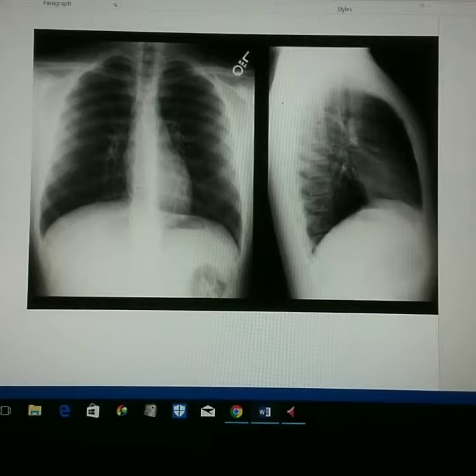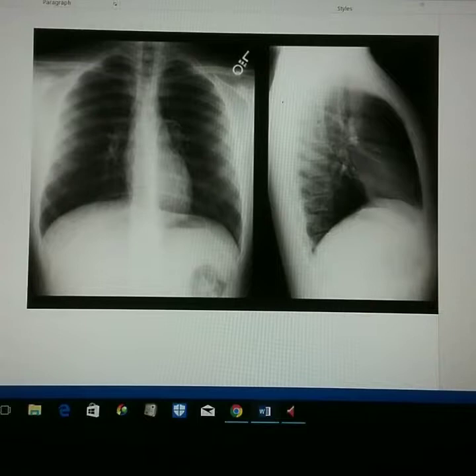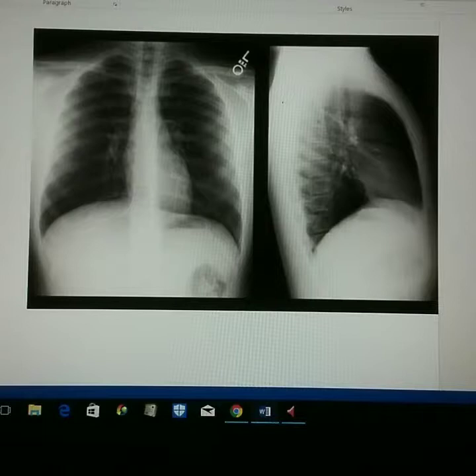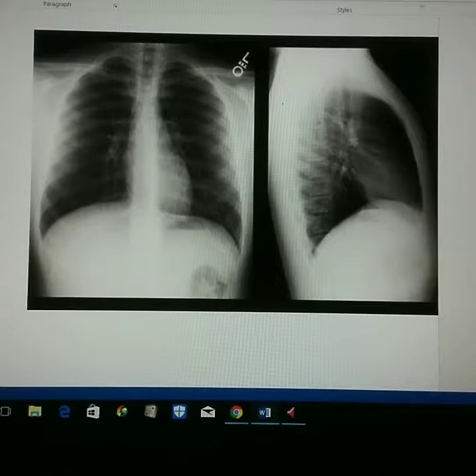We want to make sure that our patient was not rotated, evidenced by the sternal ends of the clavicles being equidistant from the vertebral column. We also want equal distance from the vertebral column to the lateral border of the ribs on each side, which we have there. We also want to make sure that the trachea is visible in the midline.